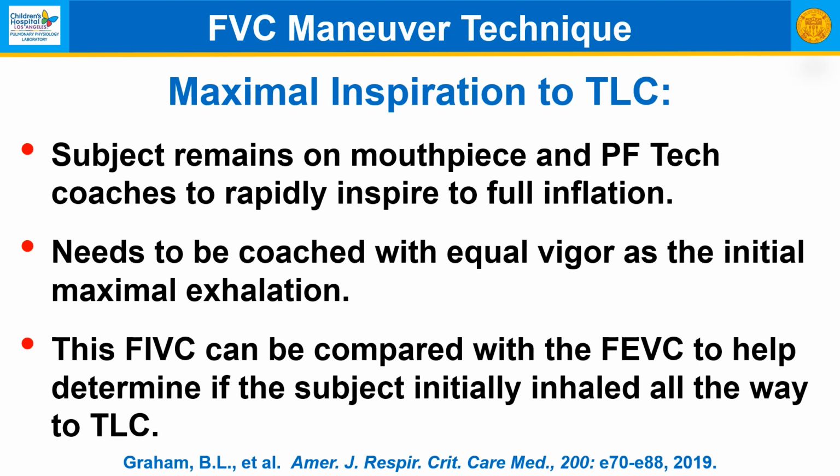Maximal inhalation and total lung capacity. The subject remains on the mouthpiece, and the pulmonary function technologist coaches them to rapidly inspire to full inflation. This needs to be coached with equal vigor as the initial maximal exhalation, and frankly, in our experience, this is hard for many children to do. This forced inspiratory vital capacity can be compared with the forced expiratory vital capacity to help determine if the subject initially inhaled all the way to total lung capacity. This sort of instruction is probably more relevant for adults than children. We do the best we can for children.